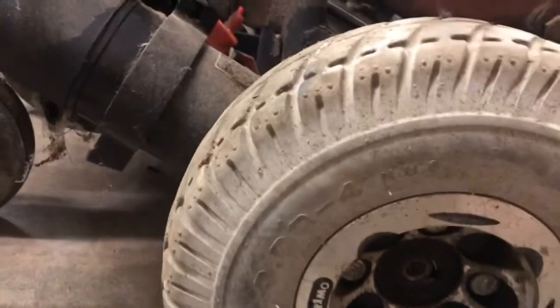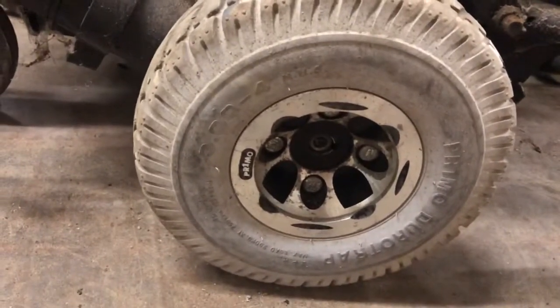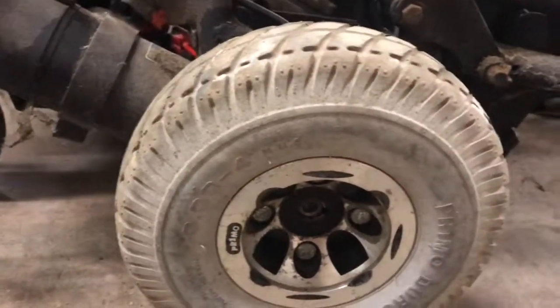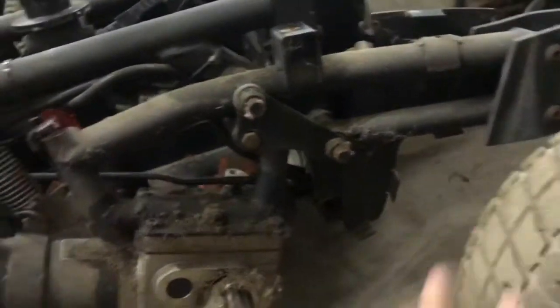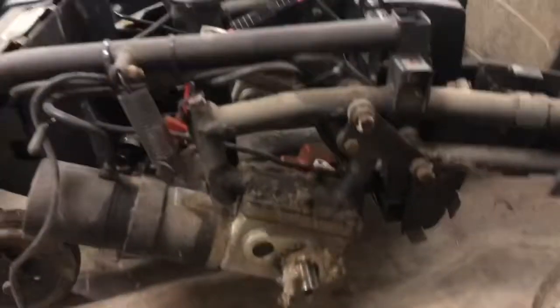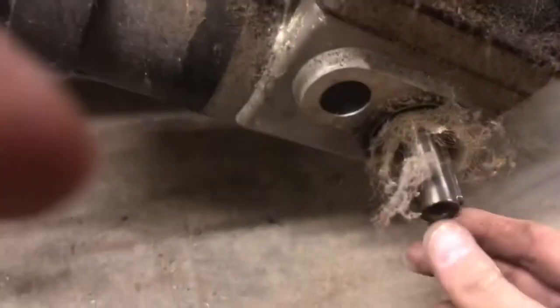Let's see here. These should come out. Now I know when you're watching a video and everything goes right, that's something you don't want to see, because when you do it, typically everything goes wrong. So let's see, look, it's coming up just straight. So obviously somebody's taken this off before. If that won't come off, I usually put the chair on its side where the frame's sticking up, and I would pull left and right and pull up on the tire as it's coming out. I know you don't want to scratch your chair, but that is an option.